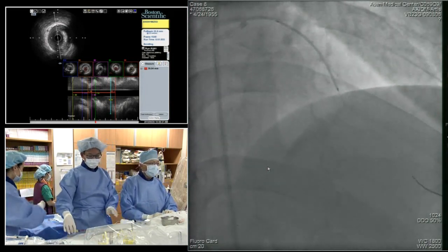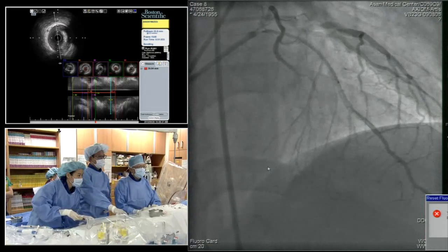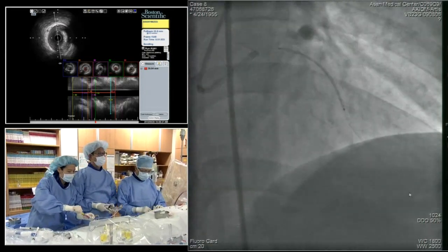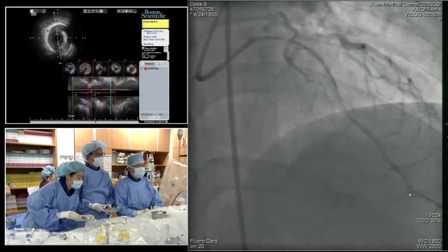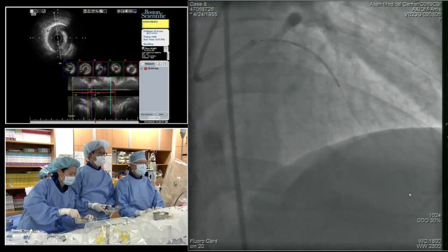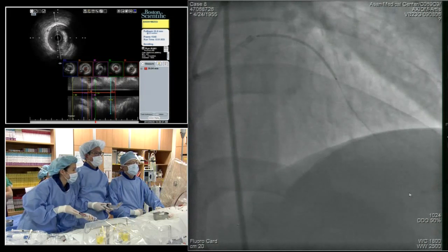So I'm too far now, I think. I'm coming back a little bit. Can you give me a test? So plenty of room. Yep. 38 would do it. Yep. So test again, with plenty of room on both sides. I don't think I have to take the stent all the way to the ostium because it gets pretty big in the ostium. But it's okay, and you saw the plaque was virtually nonexistent in the proximal section.